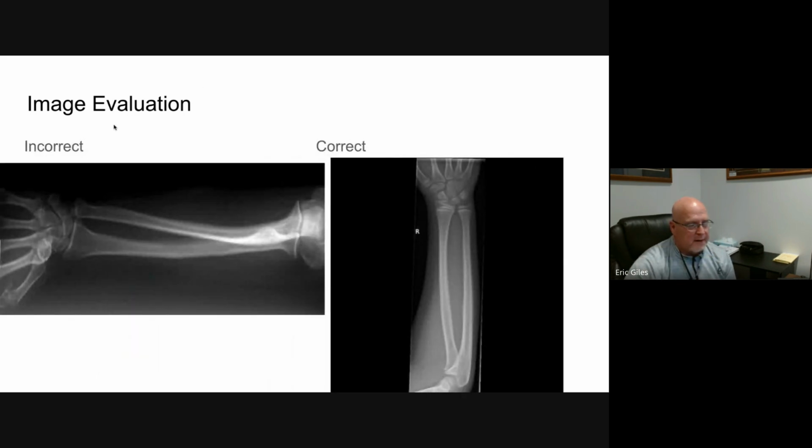Forearm. Now we've talked fingers, hand, wrist, forearm are hung from the fingers. Okay. So our image pops up, the one on the left, and it's going sideways. Okay. That's not anatomically correct at this point, okay? And we know that we've done a right forearm, right? So we're going to take and we're going to turn that image up so the fingers are up, right?